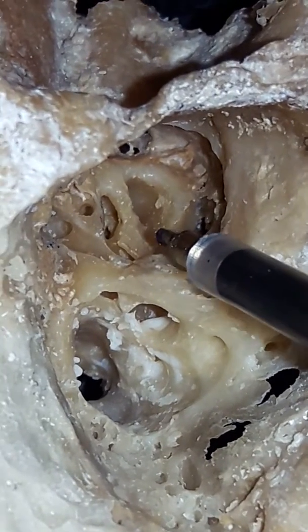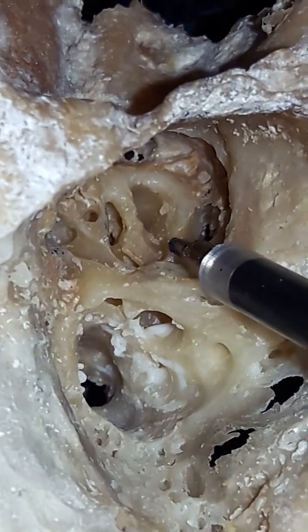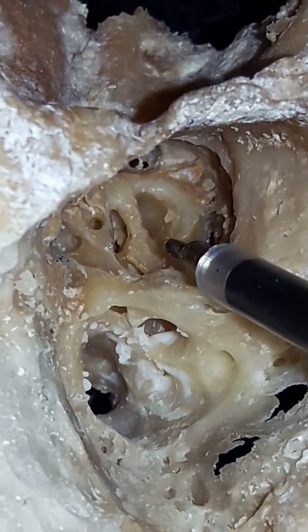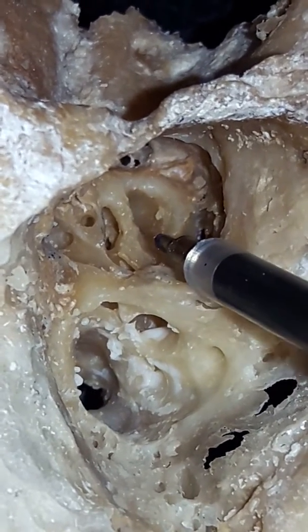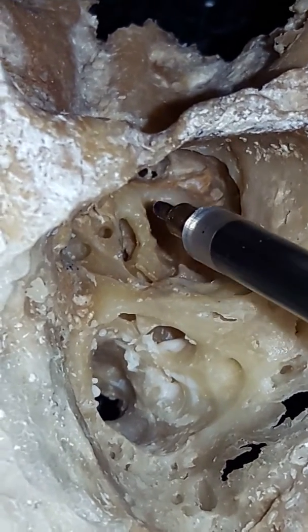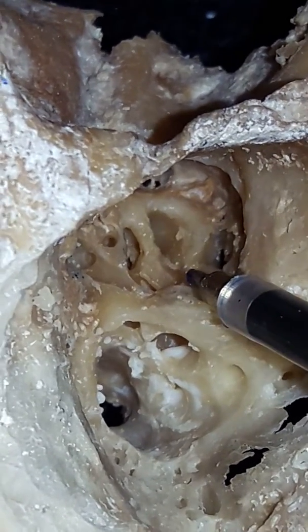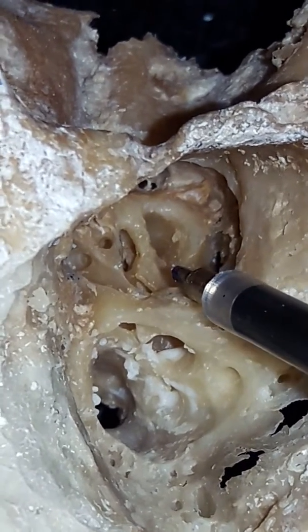But what Dr. Satish Jain is saying is, stay a little bit inferior to the anterior-inferior, which he calls inferior cochleostomy. As you pass the electrode, it is a direct trajectory to the scala tympani. So he is directly avoiding the hook area. What is the hook area?